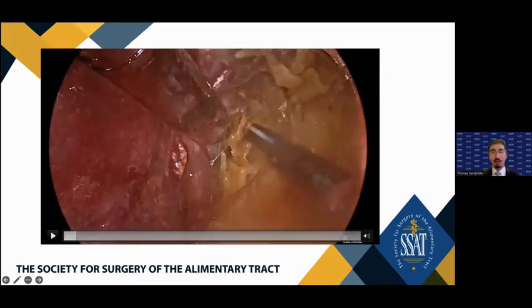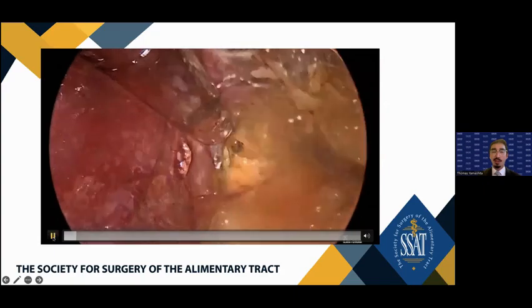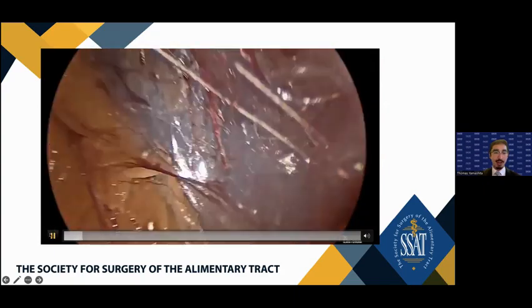I'm going to pause there. Medially, you see that red. That is paraspinous muscle, and that's the medial border of our dissection. So once you found that, you can keep on freeing things up cranially.